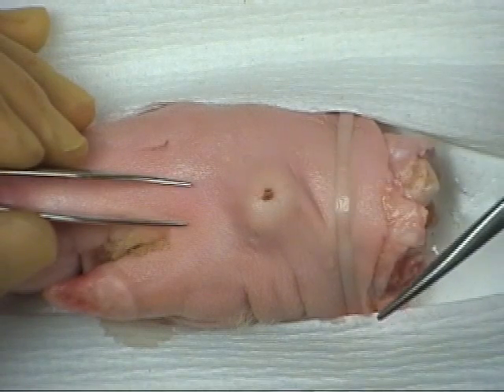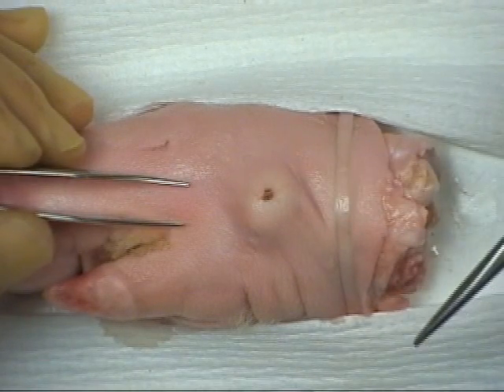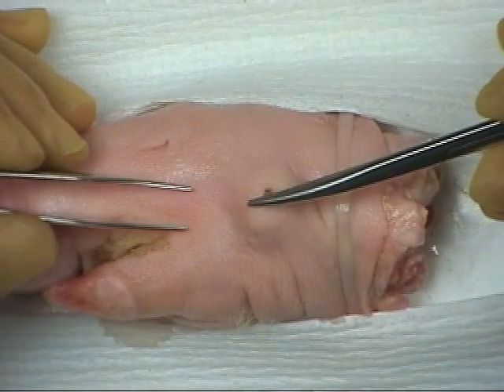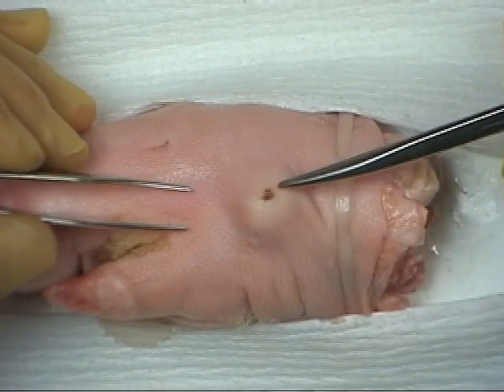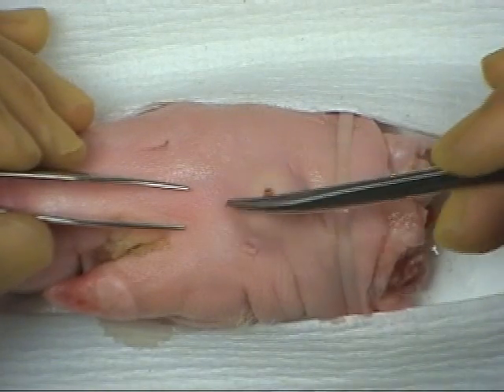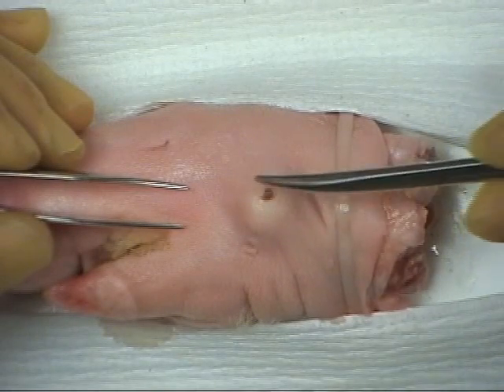Here you can see an example of a sebaceous cyst with a small overlying punctum. It is important when excising a cyst that the punctum is removed, as if it is left in place there may be recurring problems.